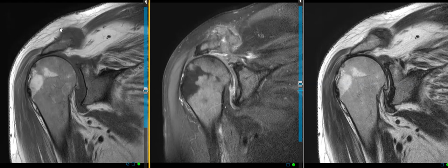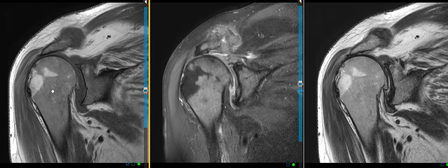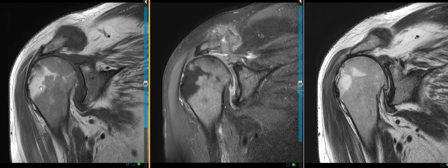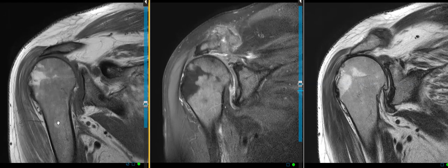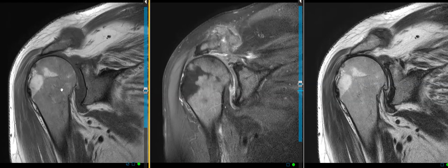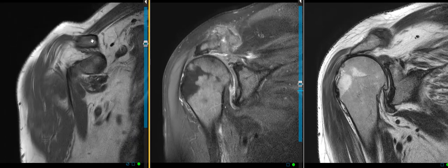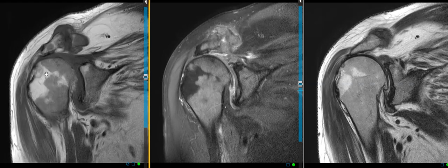The marrow pattern didn't look right. On this T1-weighted image we see bright subcutaneous fat, and normally marrow would be uniformly bright like the subcutaneous fat — fatty marrow. But in this patient we just see a little geographic area of normal fatty marrow, and the rest of the marrow throughout the humeral head, neck, and shaft is really uniform and low in signal rather than bright like fat. It looks like an infiltrative marrow process. Also the acromion process is low in signal, the glenoid is replaced, the distal clavicle is replaced — all these bones are abnormal, with only this one small geographic region appearing normal.